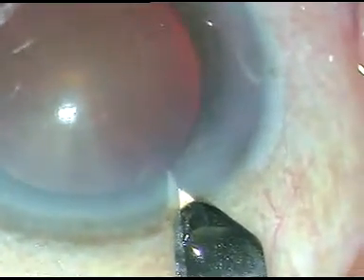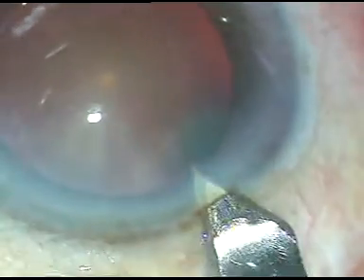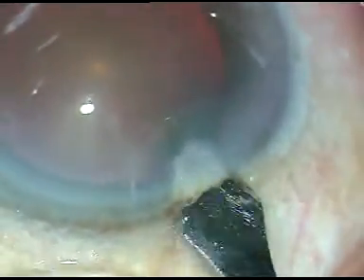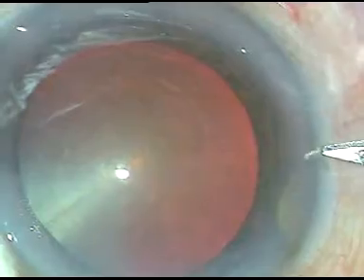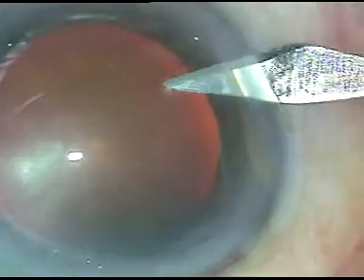Dear friends, this is a case where the rhexis wanted to run away underneath the iris at nine o'clock, and it was retrieved by a smart pull.